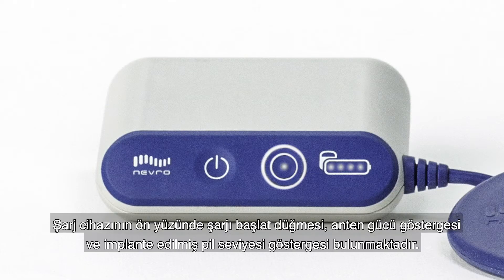On the face of the charger, there is a start charge button, an antenna strength indicator, and the implanted battery level indicator.